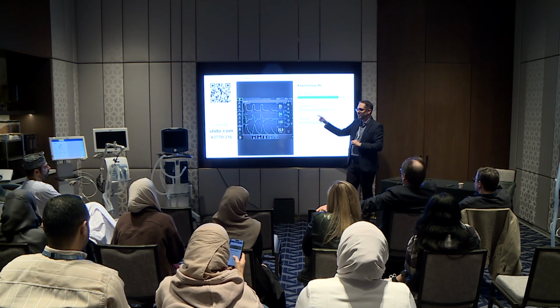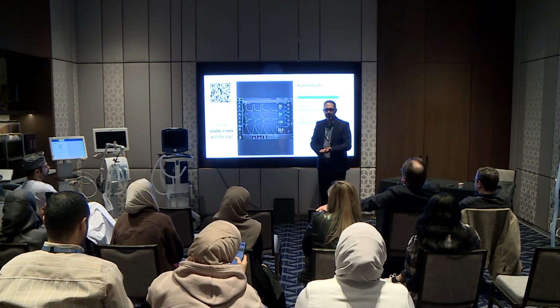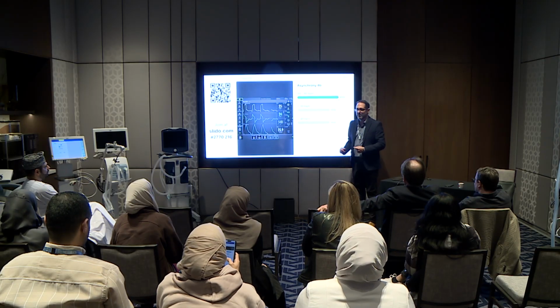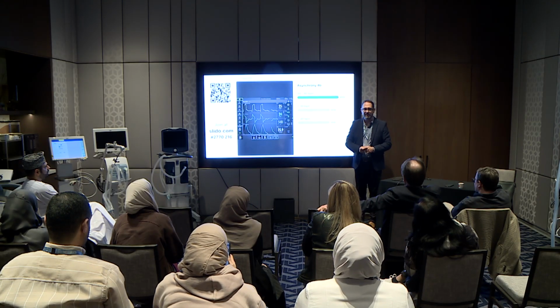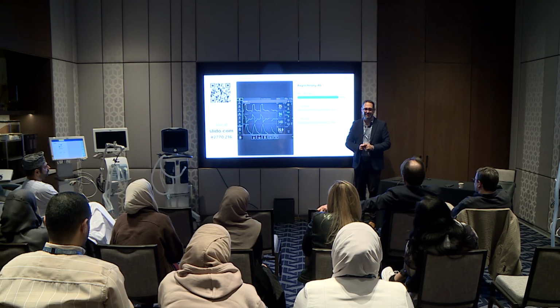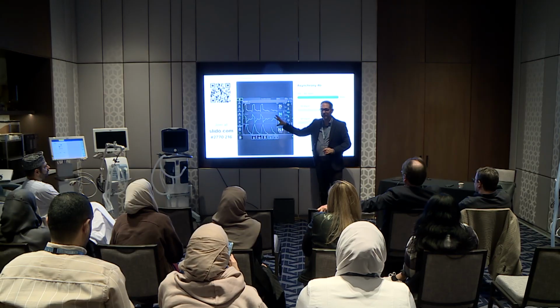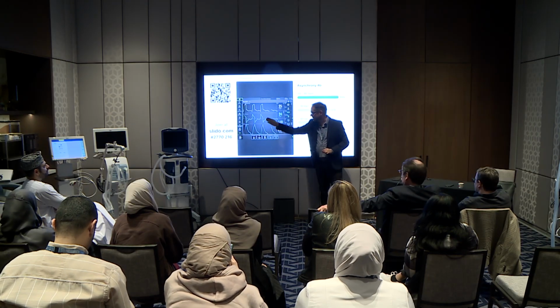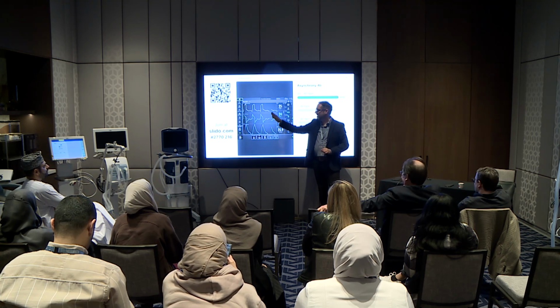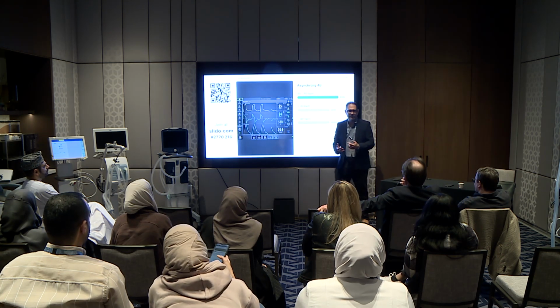This is why I said it's important to understand this, because if I walk in the room and turn my pressure support down, and now they start triggering every breath, and I walk out of the room and my respiratory rate's over 40, no one's going to believe me if I say I fixed a problem. They're going to think I caused the problem. This is important, because the patient does not look tachypneic, but they are. They're actually breathing very fast, but we are completely masking the efforts in between each breath. So when you unmask it, the question now is, what do you do about it?